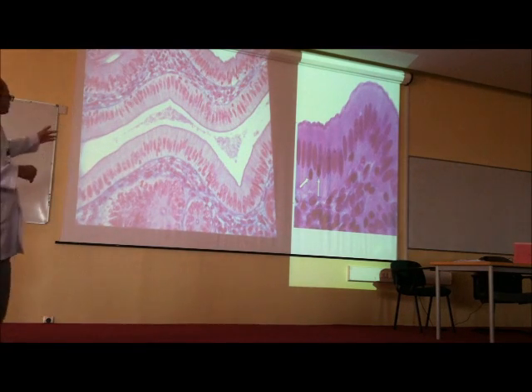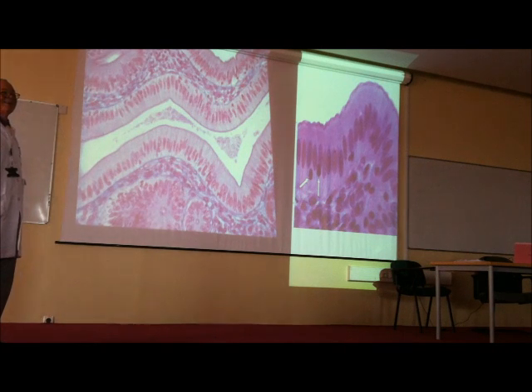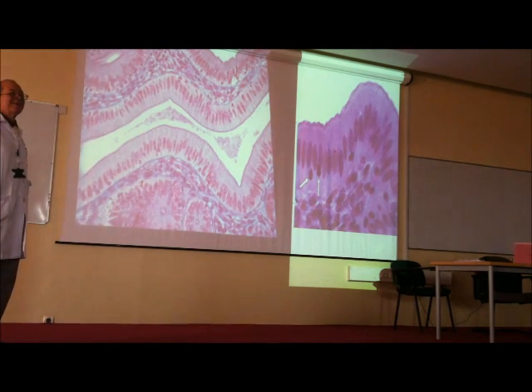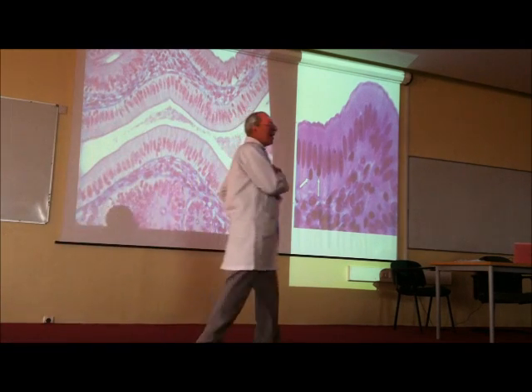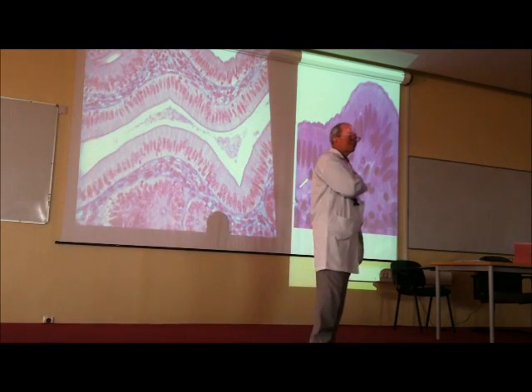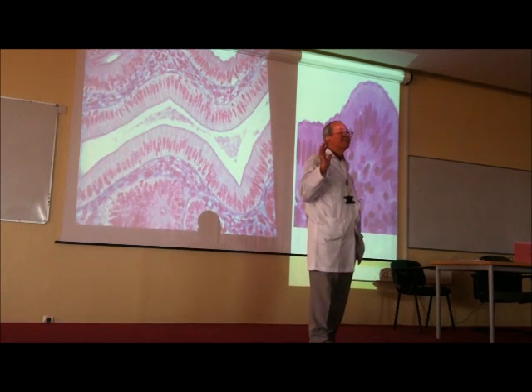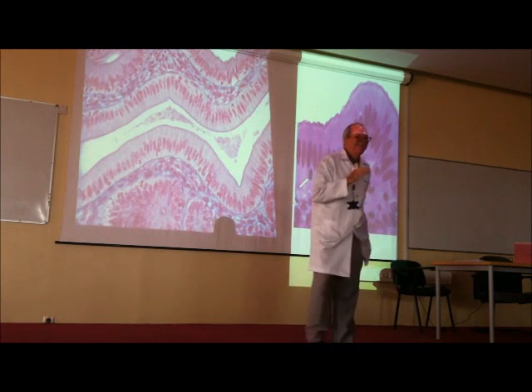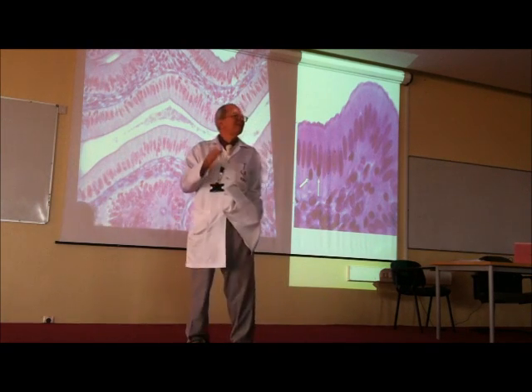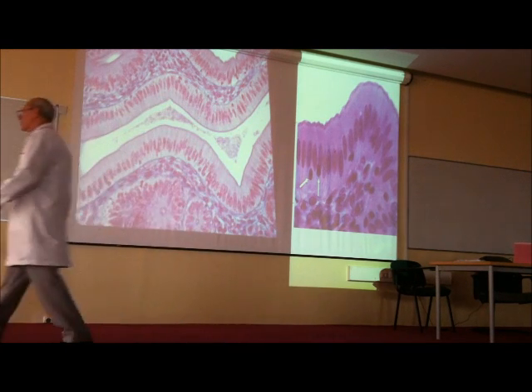What do you like? Your pictures or my pictures? Mine, because we're used to them. We've seen the same slides in lab, so we're used to them. Who accepts these pictures or prefers this type of pictures? Raise your hand. No one. Okay, I will use your pictures. I will use your pictures.